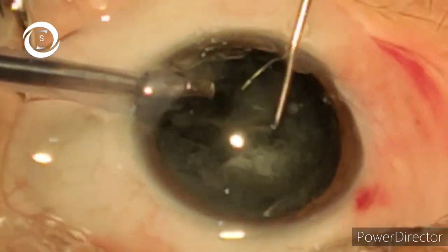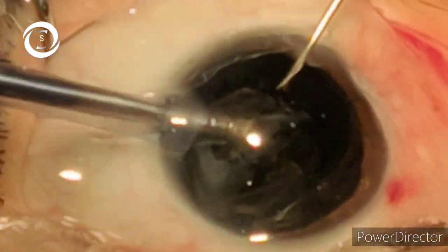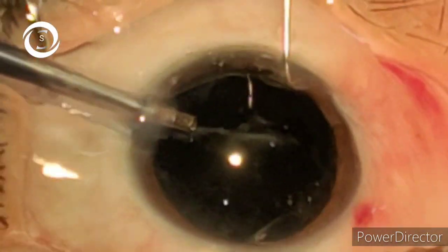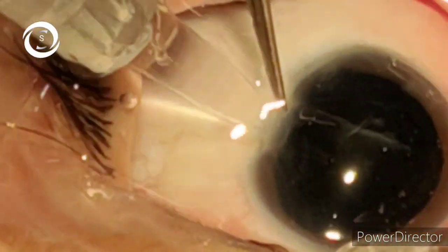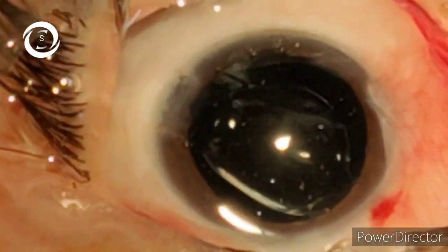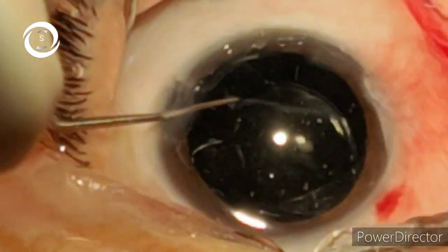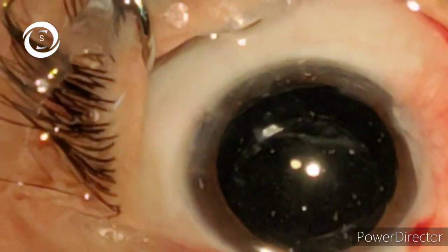I hope that in this detailed video of dividing the nucleus, it will help you a lot in soft cataract surgeries. If you look at the cortical sheets, they also came very easily with the phaco probe because of the good hydrodissection — so good hydrodissection is also a vital step. At the end of the surgery, I am putting the foldable IOL in the bag. Today we stressed upon the step of dividing the nucleus. Thank you very much.